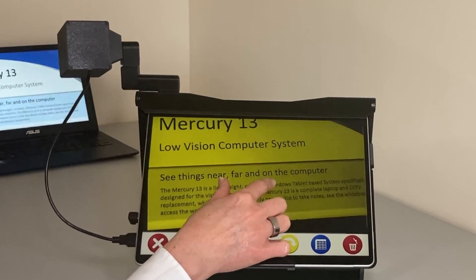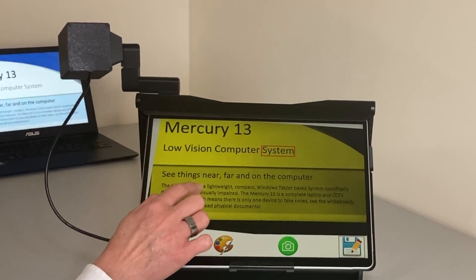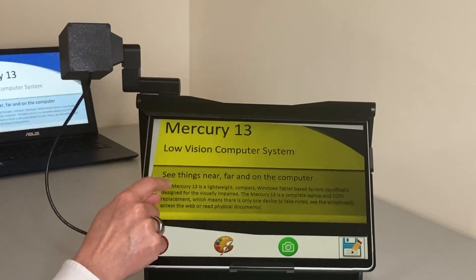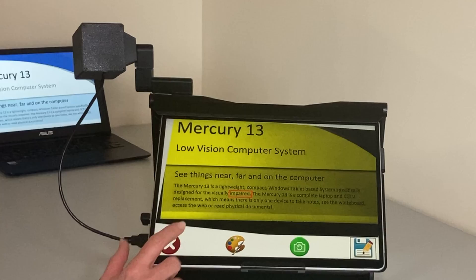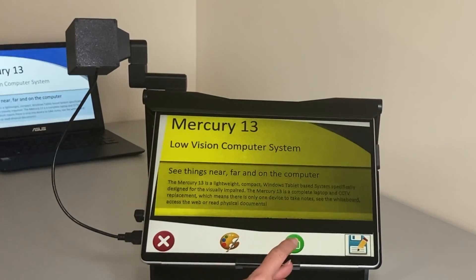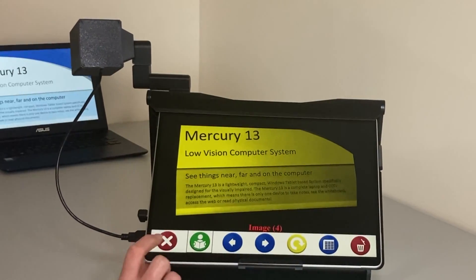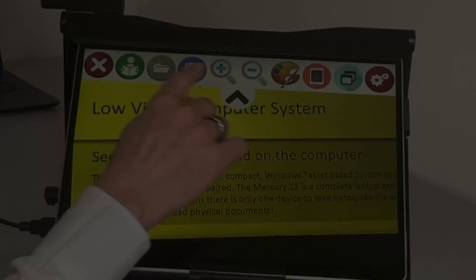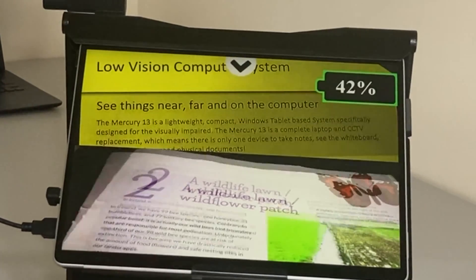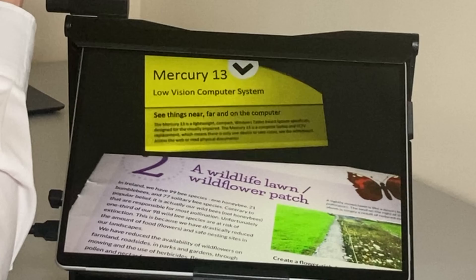We can zoom in and out on the whiteboard picture. Because this is text, I can also get it to read: 'Mercury 13 is a lightweight, compact, Windows tablet-based system specifically designed for the visually impaired.' I can pause it, save the picture, and save the text from the picture. You can also do a split screen on one screen between near magnification with your book and distance magnification of a presentation or whiteboard.